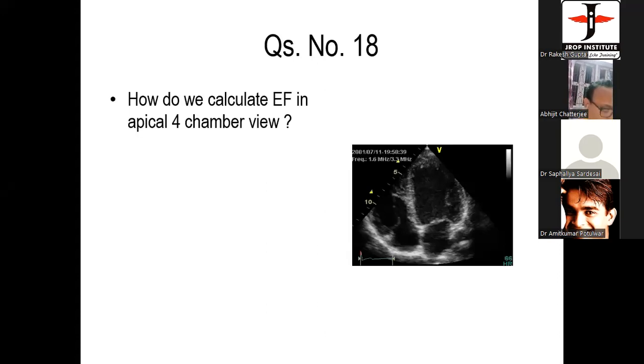I can hear you. Now, I want to measure the dimensions of the right atrium using planimetry. Describe the procedure and the cutoff value. It would be done in the apical four-chamber view, at the mid-atrial level. End systole, sir.